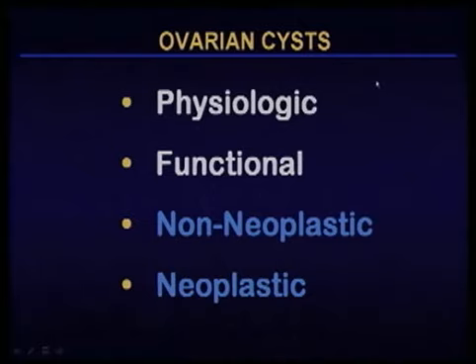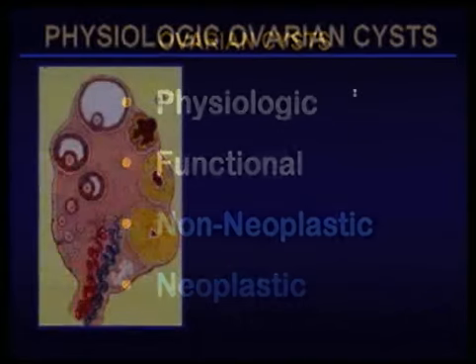So we've already mentioned that what happens to the ovary is it develops cysts. Far and away, the most common cysts that develop are the physiologic cysts associated with the normal menstrual cycle. Sometimes the cycle becomes a bit confused and you no longer have a normal cycle, and this is because of the associated hormones, typically estrogen and progesterone, that cause the cycle to become abnormal, and you develop what we call functioning ovarian cysts. So far and away, these are the most common.